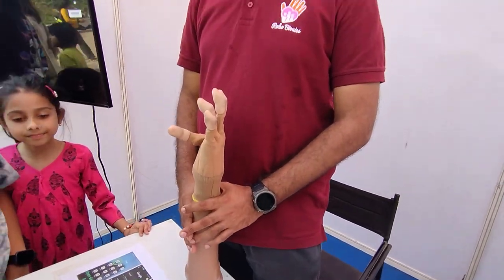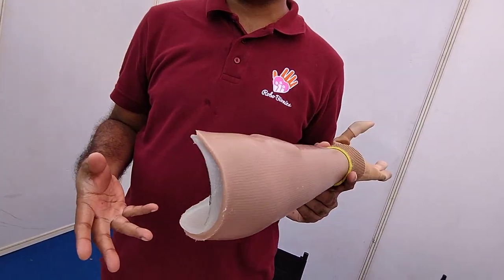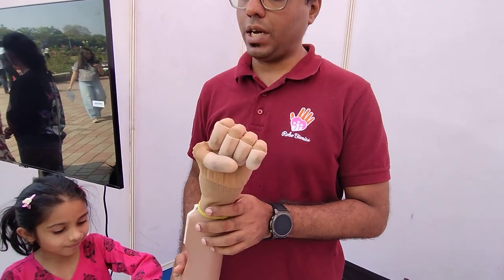This is an artificial hand. It is used by people who lost their hand in an accident or trauma. The way this works is, if you see the blue sensors here, it measures the muscle activity of the user, and it acts as a trigger to open and close the hand.